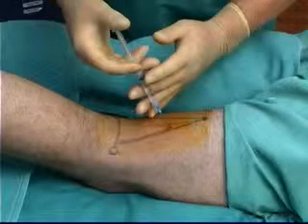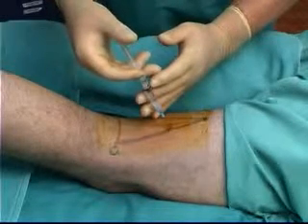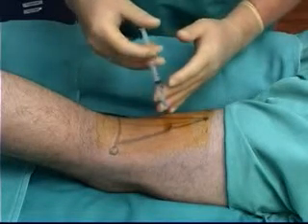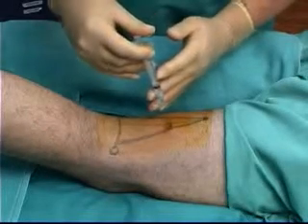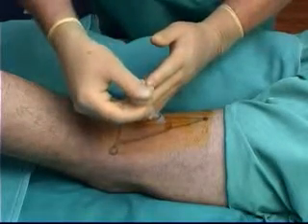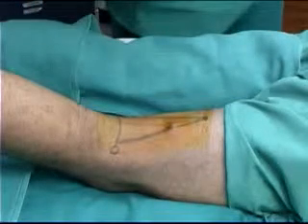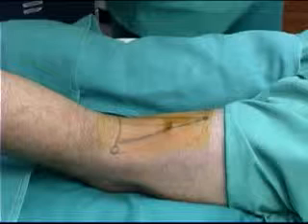The tendons of the biceps femoris and the semimembranosus muscles are palpated and marked. These tendons usually meet to form the apex of a triangle of which the base is the skin crease behind the knee. A line perpendicular to the baseline of the triangle is dropped from the apex of the triangle, and needle entry is slightly lateral of this line, 7 to 9 centimeters above the crease.